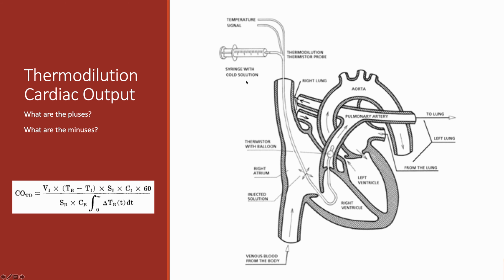So what do we do with the pulmonary artery catheter? Well, one of the things we can do is measure the cardiac output. I copied and pasted this from Swan-Ganz's original paper in, I think, JAMA in 1971 or so, where this was the new thermodilution method that they developed for determining cardiac output. Until then, they had injected green dye in.